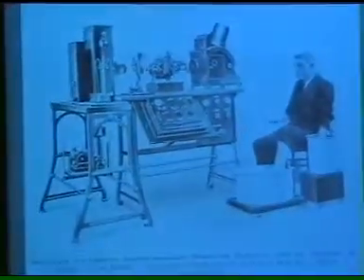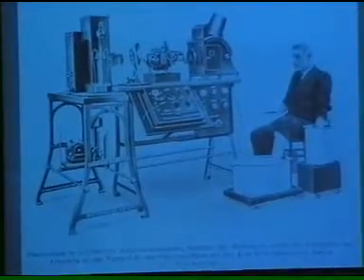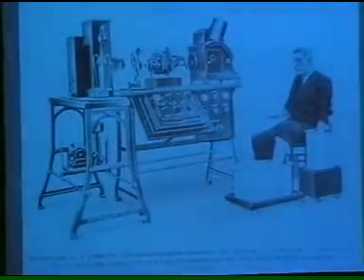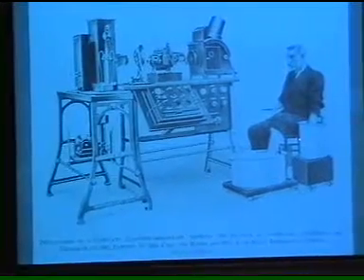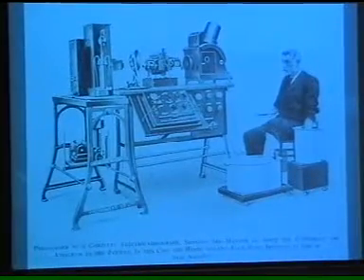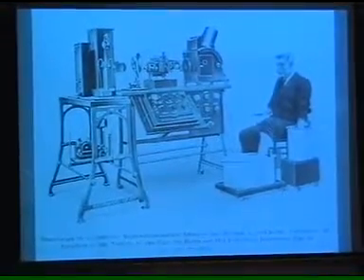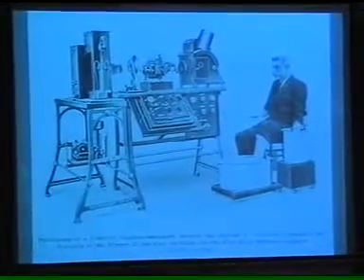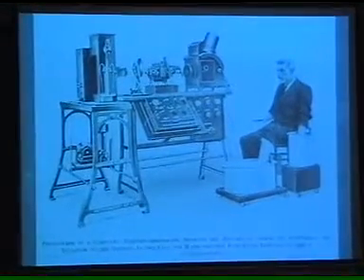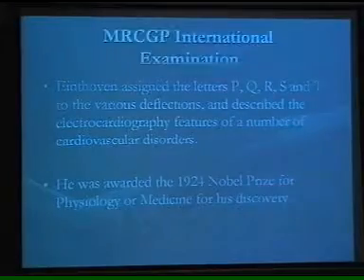Let me start my presentation with this picture. Can anybody recognize who this gentleman is? Look at the picture. There's a person sitting, his hands are immersed in water, both hands and one foot, and there's a big machine which is recording something. There's a very famous name in the history of ECG. Although the history of ECG is very prolonged, this is a picture of a person named William Einthoven.